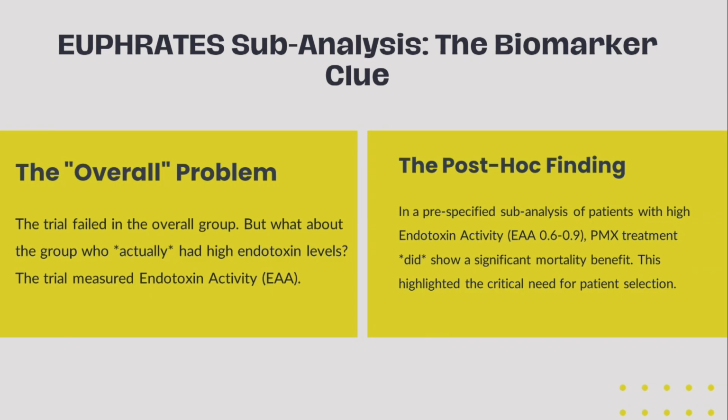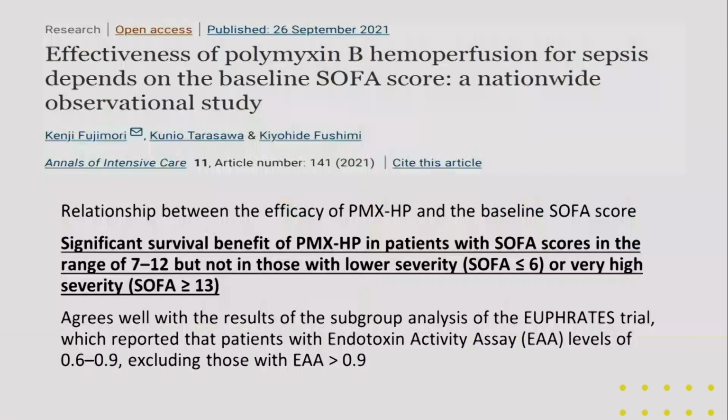And it was the post hoc finding that did show significant mortality benefit, but it highlighted the critical need for patient selection. So if our patient selection is good, probably these cartridges will work well. Then after all this came a nationwide observational study which gave us a survival benefit in these patients.